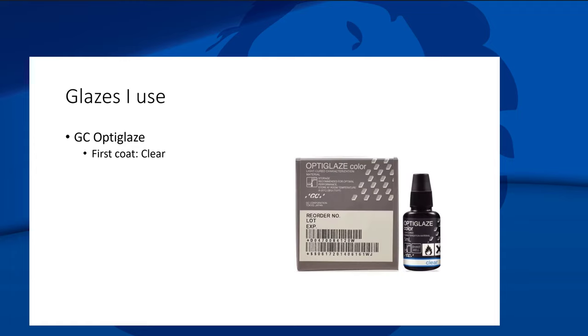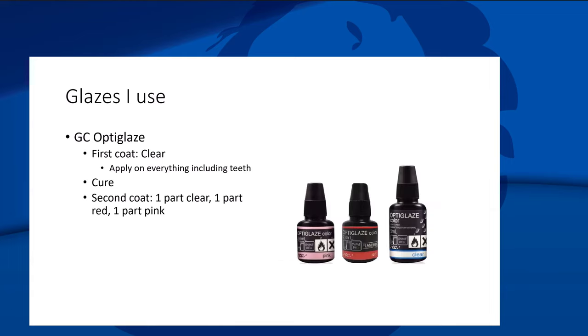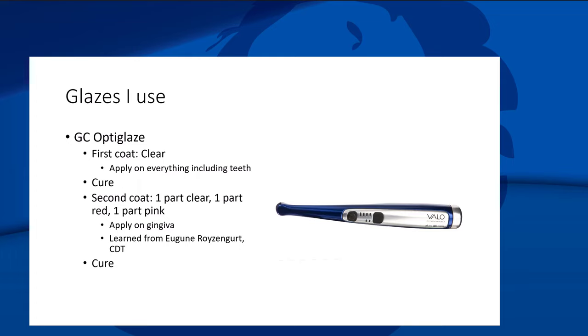For glazing, I like OptiGlaze and have been using it for a couple of years. First coat is clear, applied to everything including the teeth — looks really nice. The second coat is a combination of one-part clear, one-part red, and one-part pink, brushed onto the gums in one or two coats, then cured with a curing light. I learned this from Eugene Roizen, a denture tech I follow on Facebook. If you don't like the result, just cut it off with a ceramic bur on a lab handpiece.